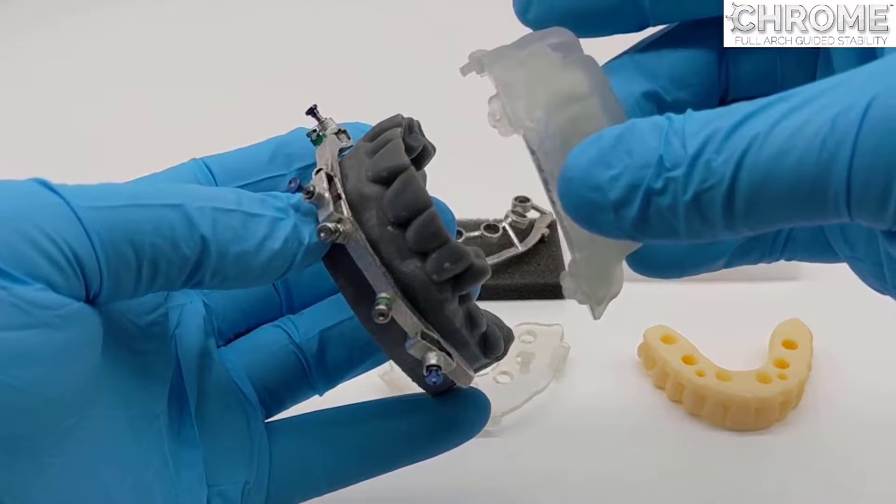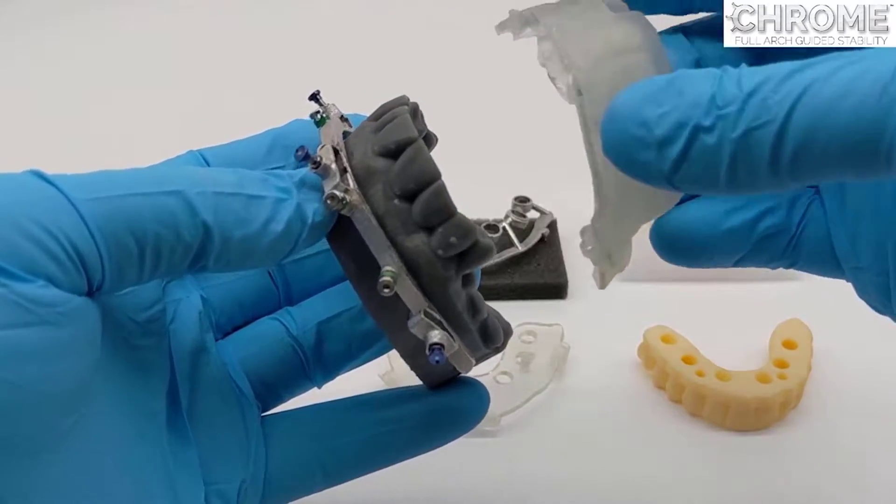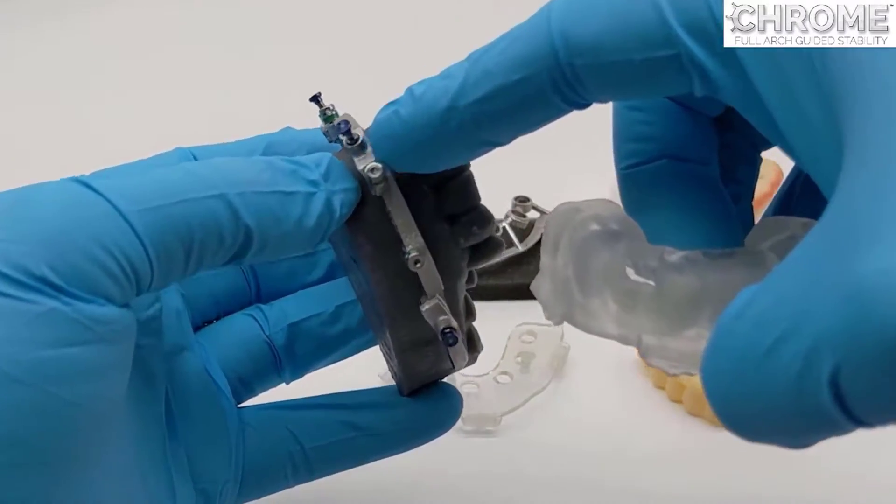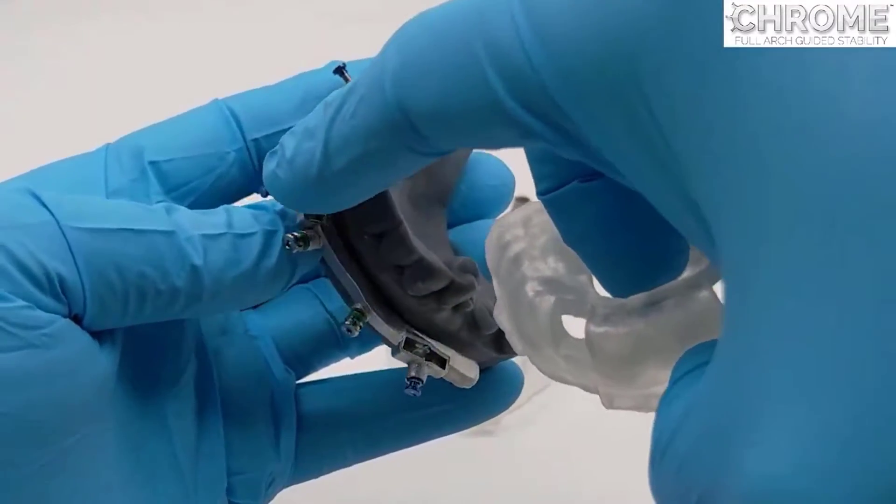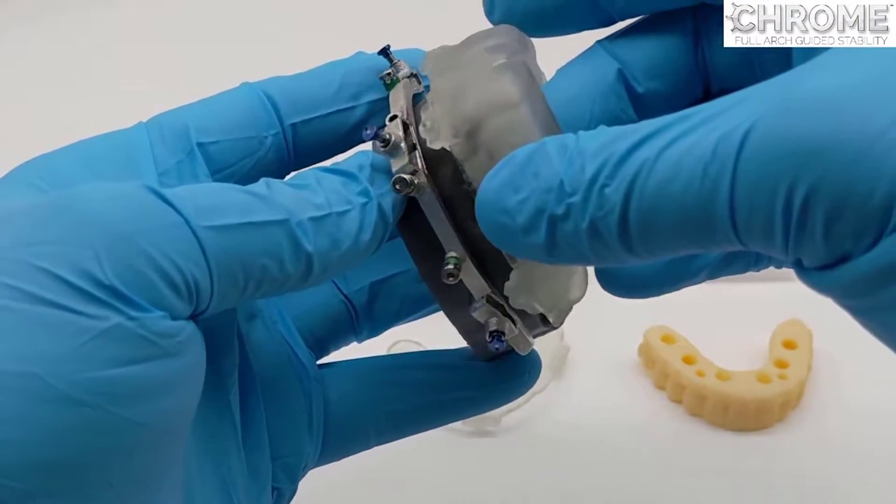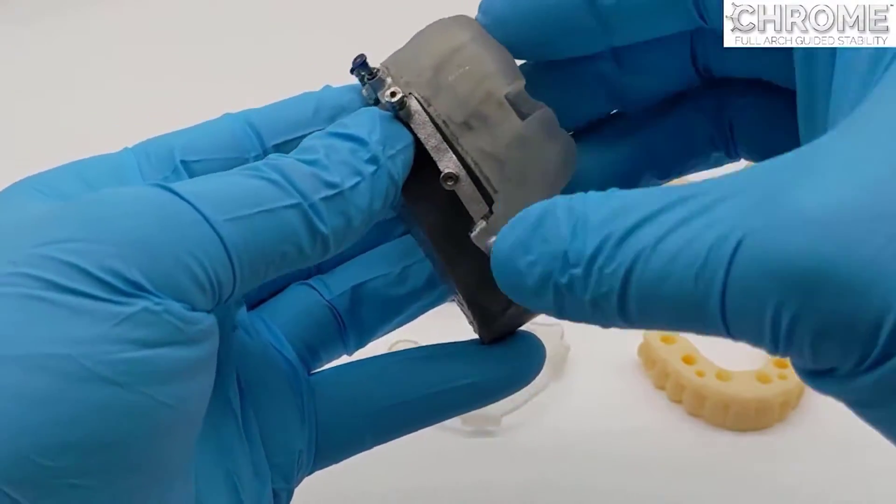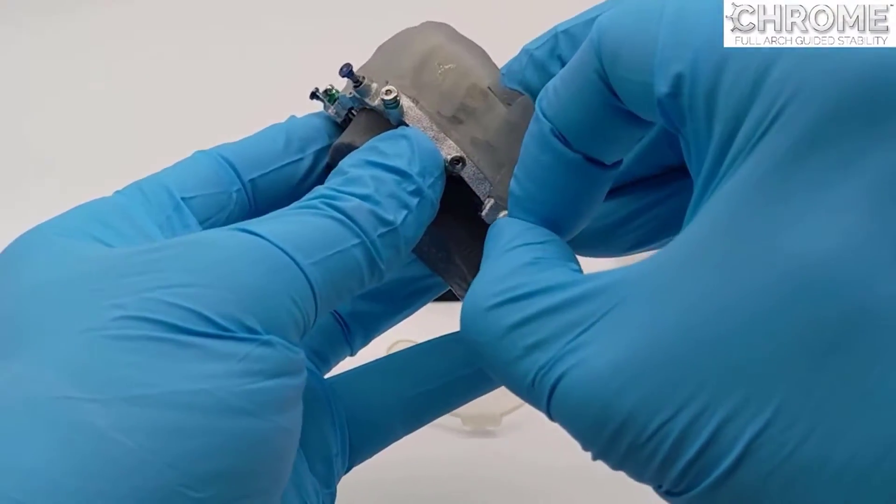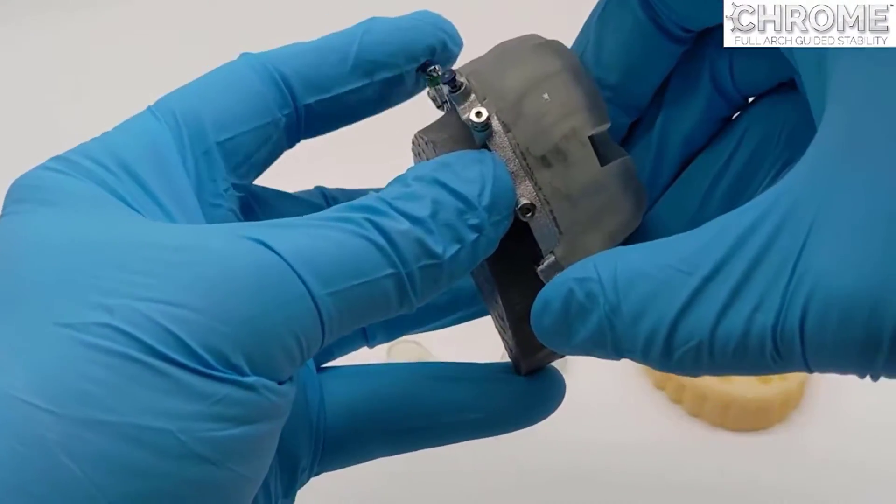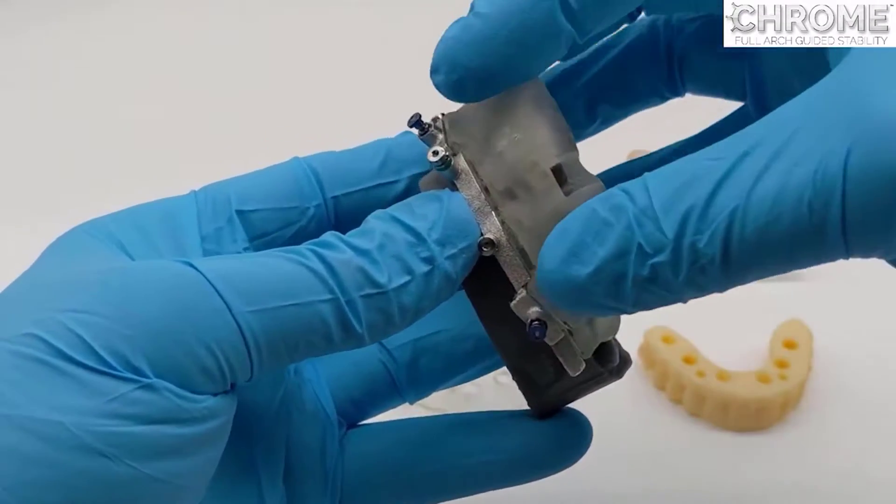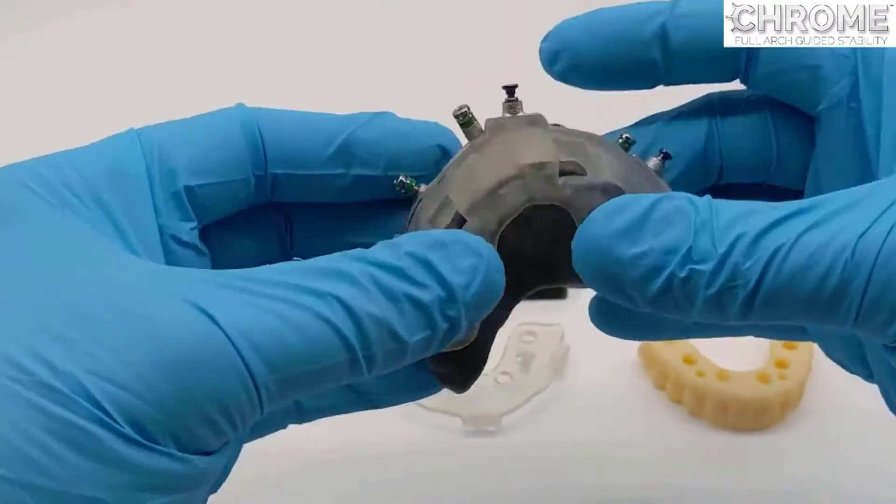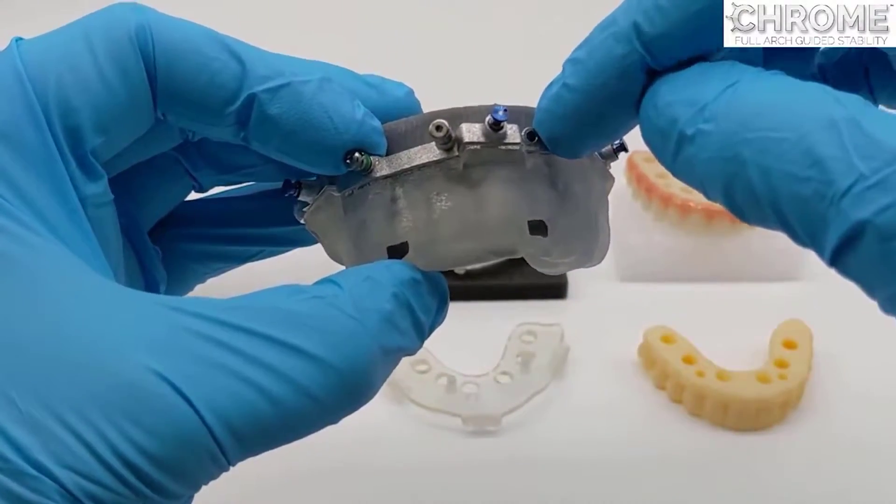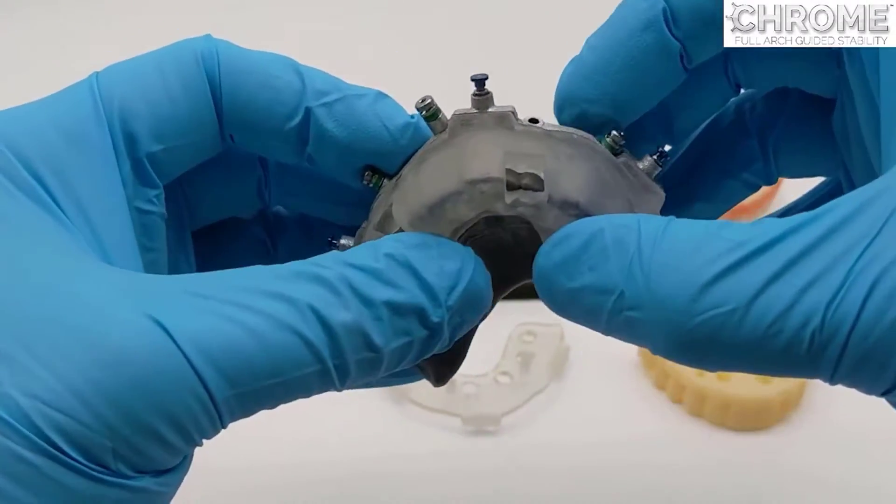Then it is removed and assembled to the fixation base using the chrome locks—one, two, three. They are attached outside the mouth and then they are clipped together with the chrome locks, and then they are delivered. The pin guide delivers the fixation base.